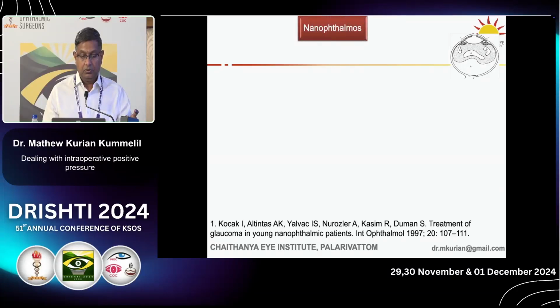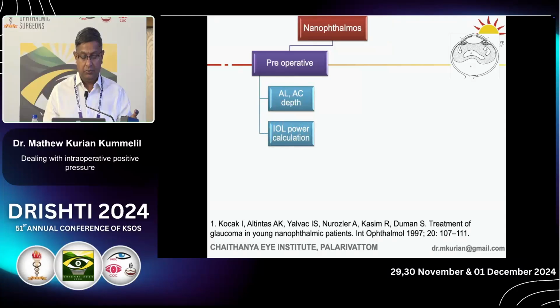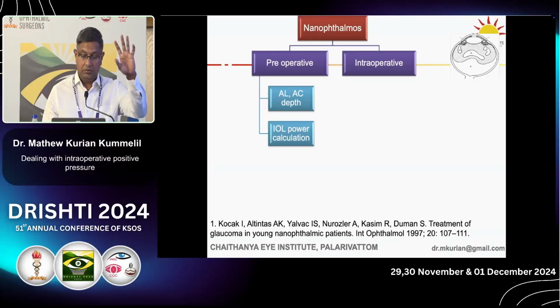it was actually a nanophthalmic eye. So what are the intraoperative challenges in nanophthalmos? We have to look at these things to realize that it is a problem there. During our biometry, we never look very closely. We just look at the IOL power and forget the rest.